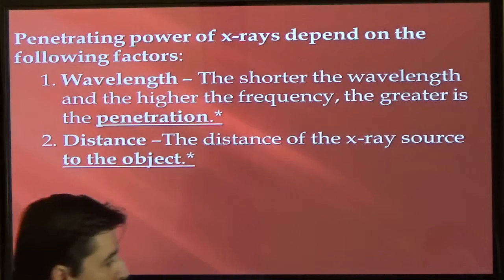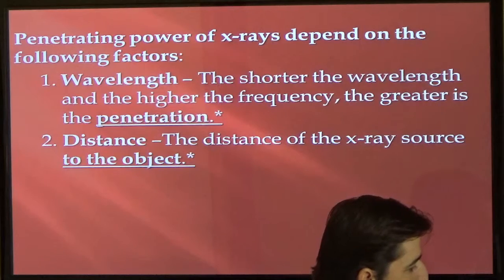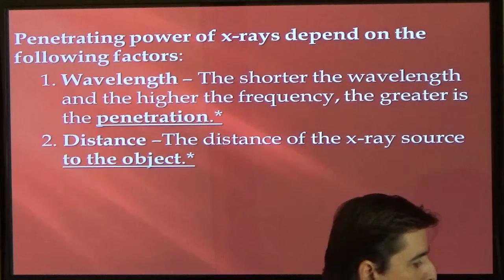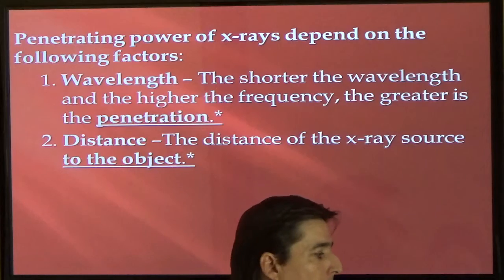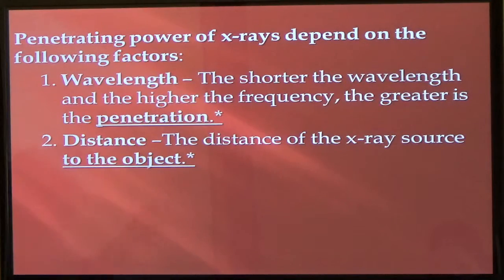The distance: if I have my beam really close, obviously it's going to be stronger. You're going to get more penetrating power because of the shorter distance. If I get way back here and start to shoot X-rays, you're going to have less penetrating power. So again, the wavelength matters, and the distance of the X-ray source.